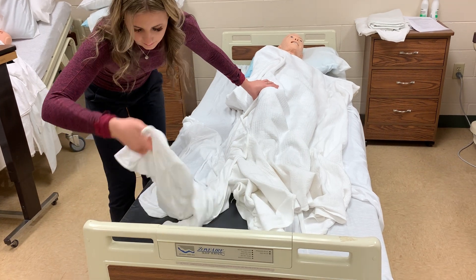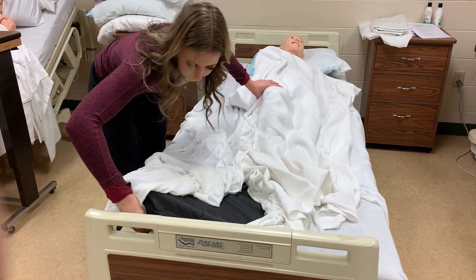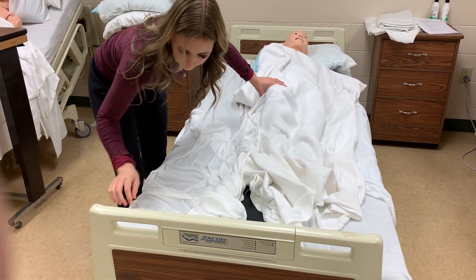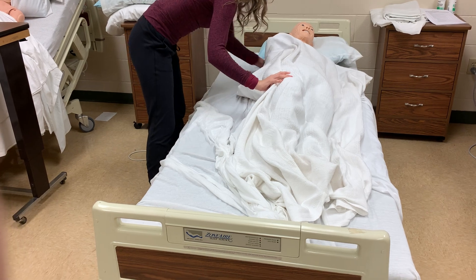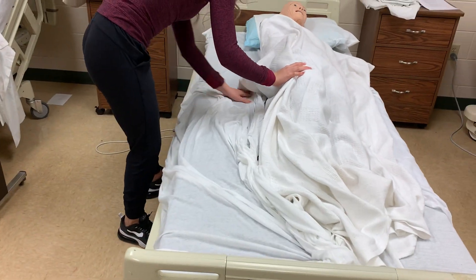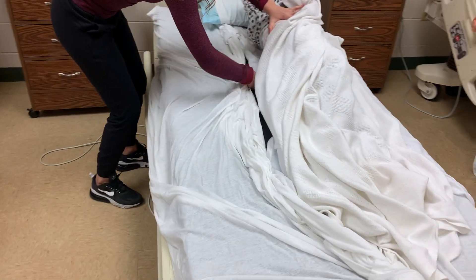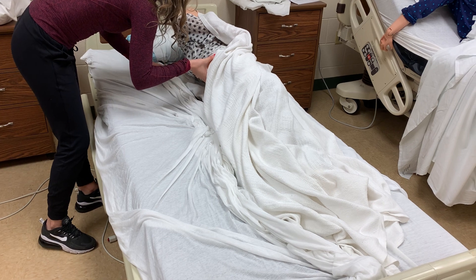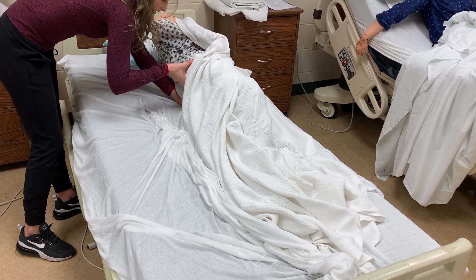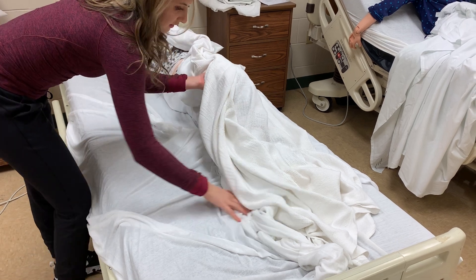Tuck the bottom in. You want to try to get out as many wrinkles as possible when you put that sheet down. Then, same thing — roll the clean fitted sheet so it's not touching any of the soiled linens, and tuck that under the patient as well.